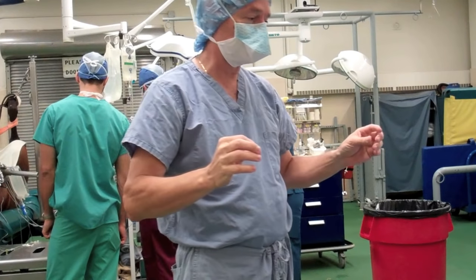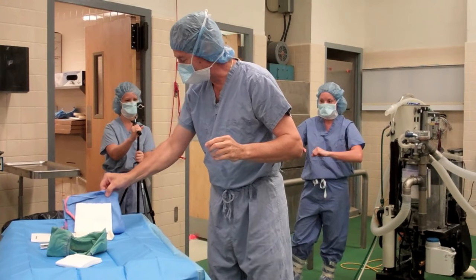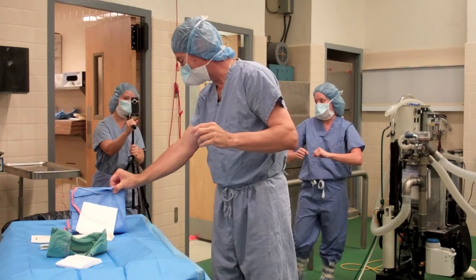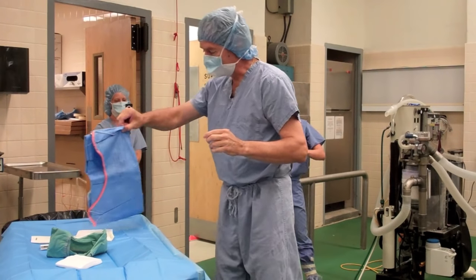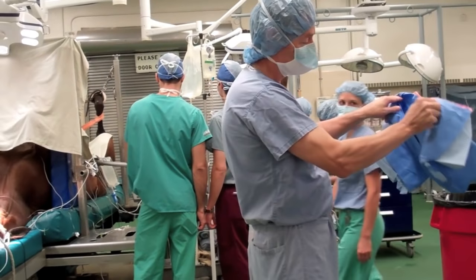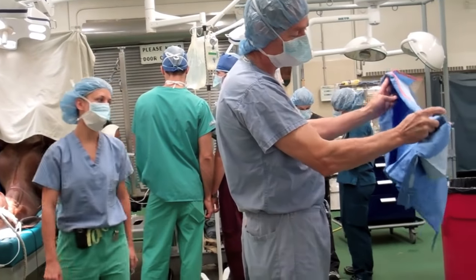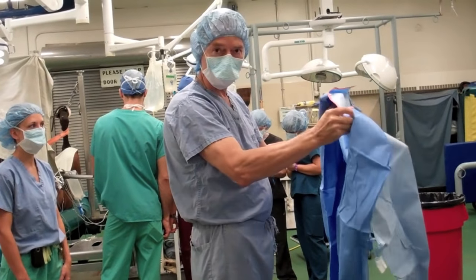Now I'm ready to don my surgical gown. I'm going to pick up the surgical gown, being careful not to touch the front of the gown, the floor, or the sterile field. I'll step away from the surgical table and shake this gown out. Now, if these gowns are properly folded, you're touching the inside of the gown.